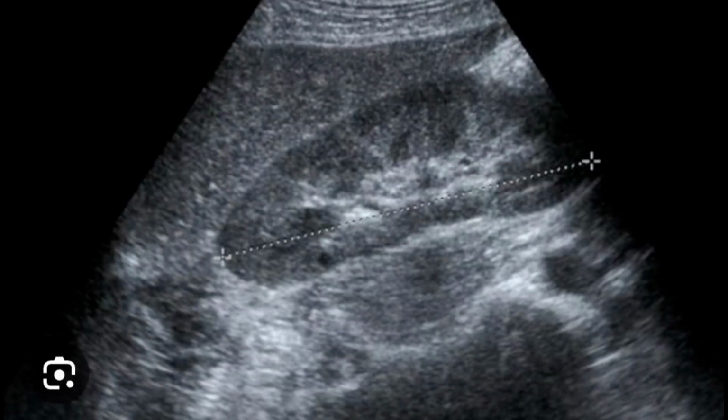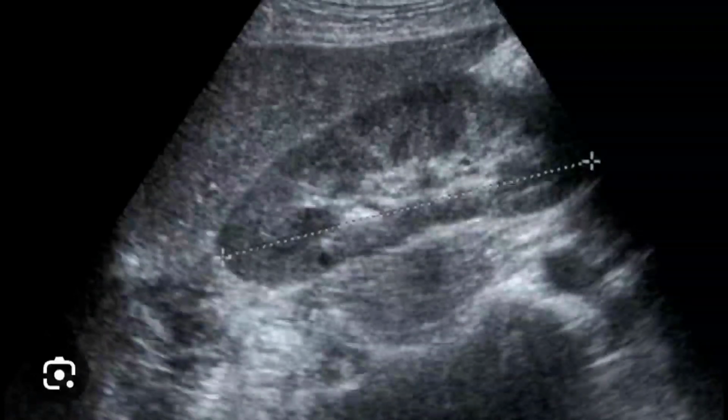The blood iron level was monitored and was increased, and on ultrasound imaging the liver shows increased reflectivity. So there is no pattern of cirrhosis. Liver margins are normal. Liver reflectivity is slightly increased because of the iron overload.